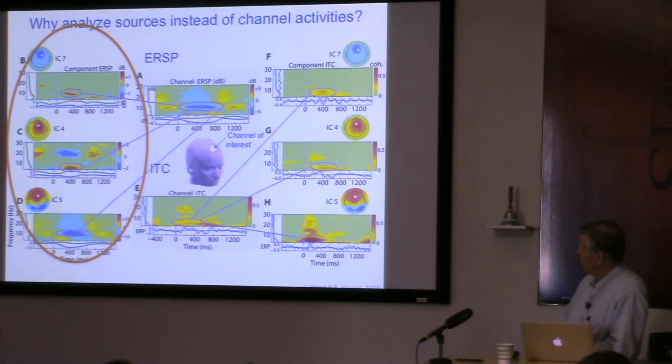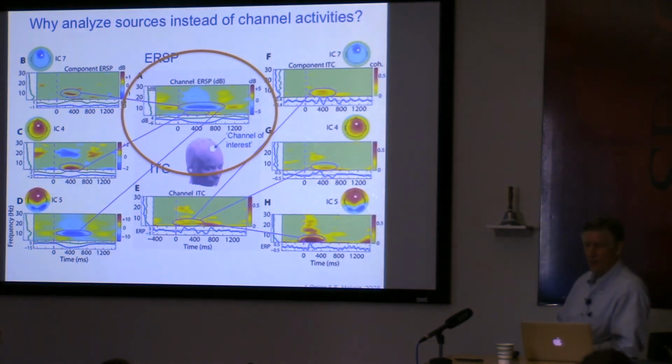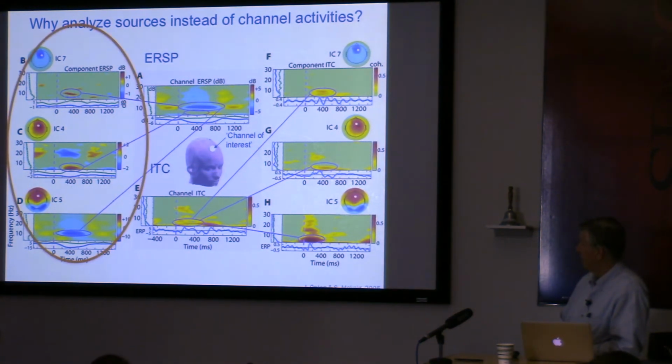And so this ERSP is calculated on a sum of things, and these are some of the dominant processes that it actually sums. Although power is not summed linearly: the power of a sum of things is not the same as the sum of the powers of things.